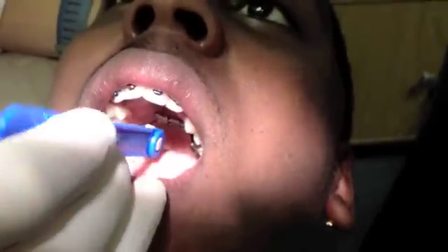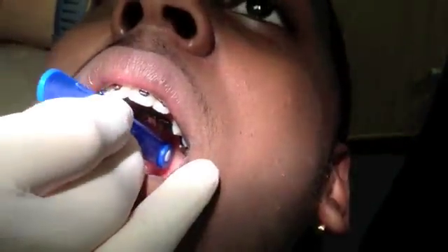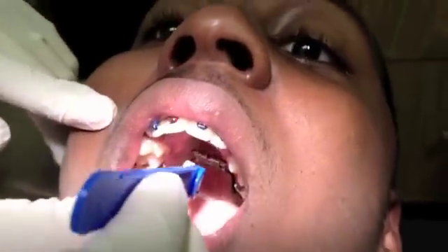The first thing I do when demonstrating how to turn the RPE is introduce the patient to the key. I always make sure to tell the patient that the big white knob should be on the right-hand side for reproducibility.